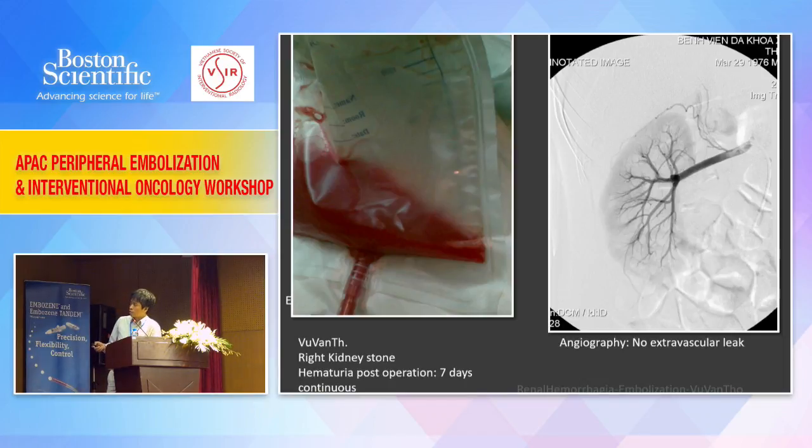But on the angiography, we perform the angiography, but we do not see anything like a lesion here. So now it's very difficult for the surgeon and for us also. We refuse to perform the occlusion, some kind of embolization here. But the surgeons ask us that we must do something to stop the bleeding.